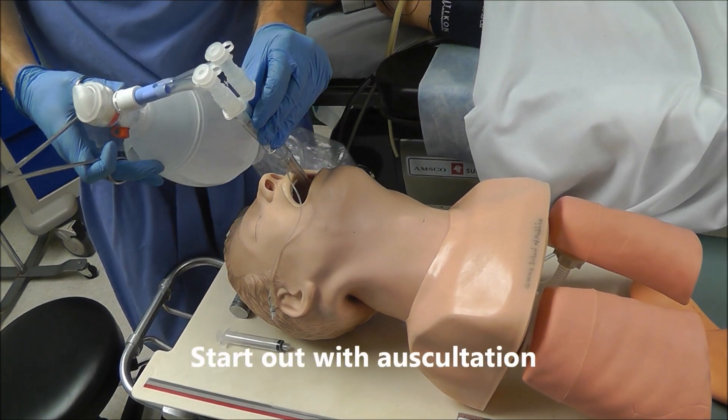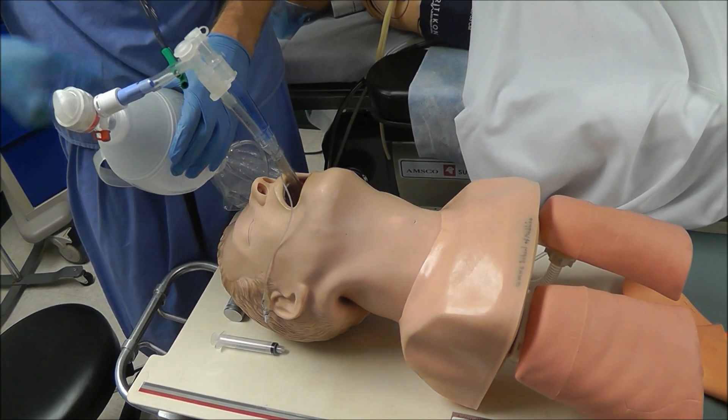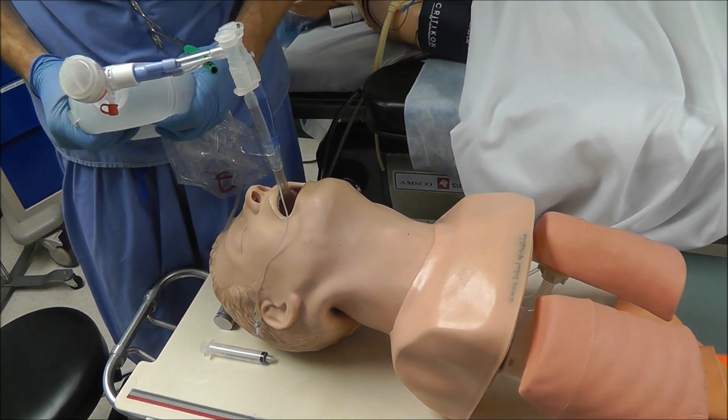The first method is auscultation. To do that, you need to clamp one of the lumens. Here I'm going to clamp the bronchial lumen, so if this is correctly placed, I should only hear breath sounds on the right side. And you can see that that's true — I can only hear it on the right side.